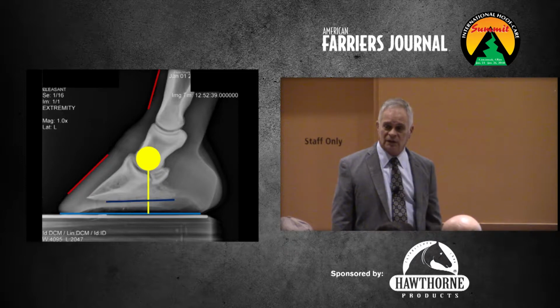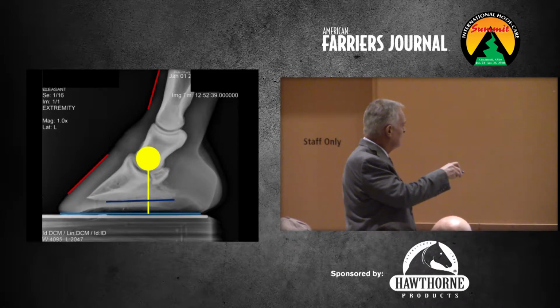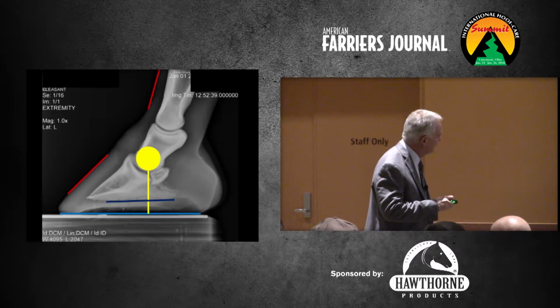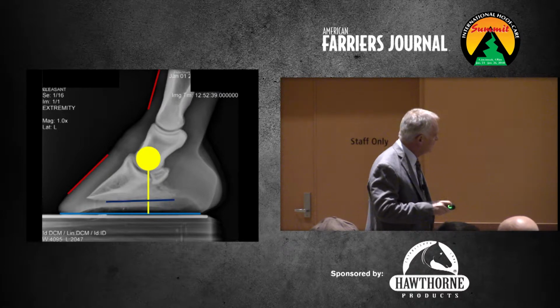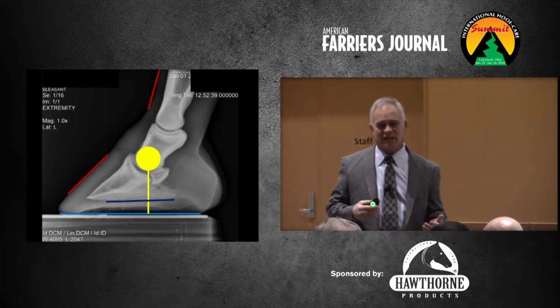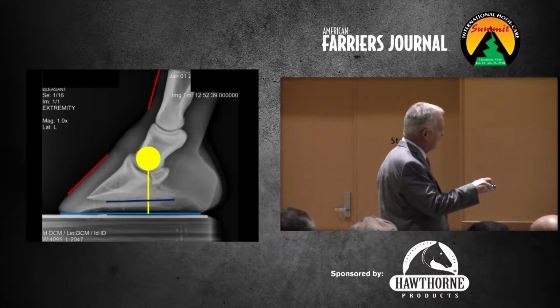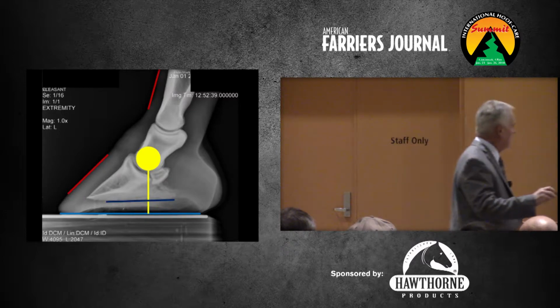Okay, so those two. Is he aligned up front? Is he matched here? Looks pretty good. How about sole depth? Yeah, so again, you can't really see, but these machines do have an internal marker, and that's probably 15, maybe 18 millimeters. So what that should say to you is I don't have a lot of foot to work with on this horse. You could say maybe his toes pushed out a little bit. Okay, but those are the things you should be thinking of.